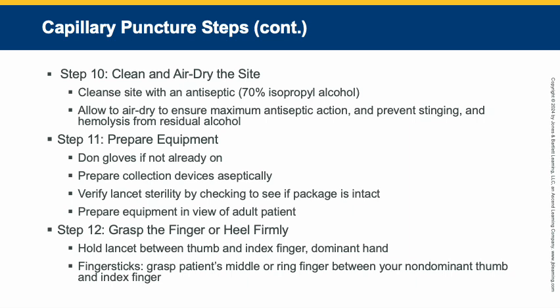After cleaning it, allow the site to air dry to ensure maximum antiseptic action and minimize the chance of alcohol contamination of the specimen. Residual alcohol, in addition to causing a stinging sensation, can also rapidly hemolyze red blood cells.